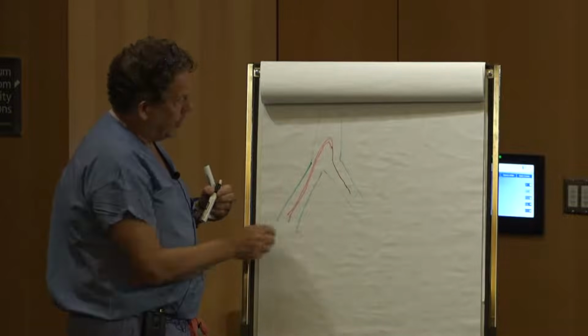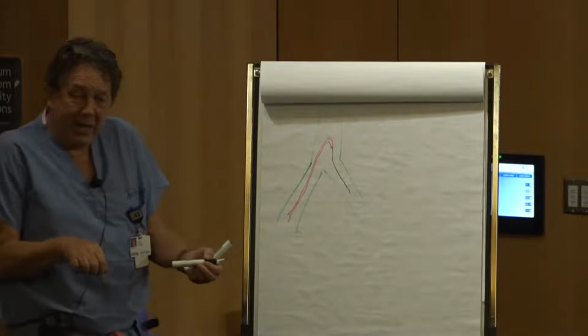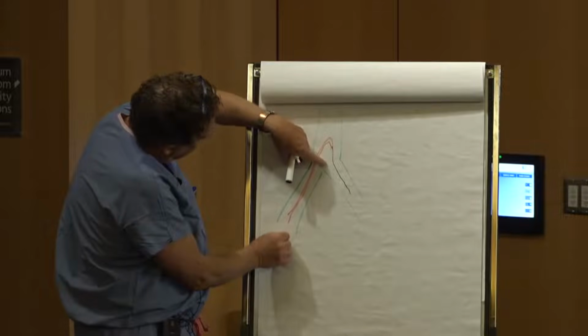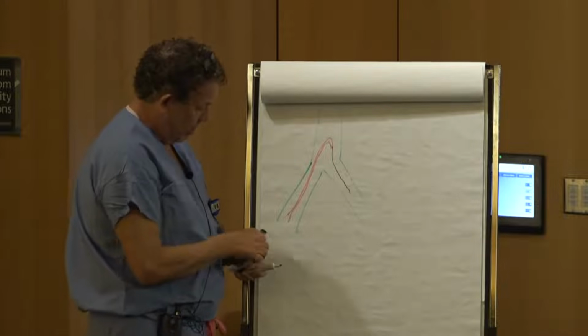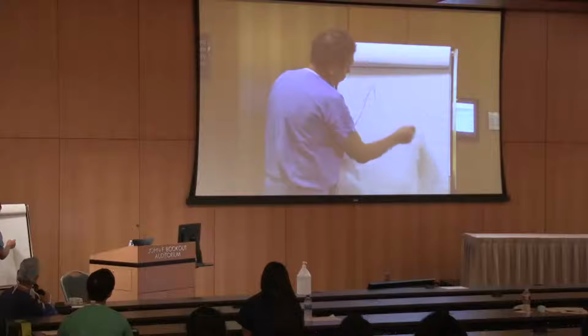So what he's talking about is, the words we use are "shorten the wire." You've got a hold of the back of the wire, and you're pulling the wire down at the same time as the catheter is coming down here. What I typically want to see when you set this on the bifurcation is, I kind of overdo it to start with.